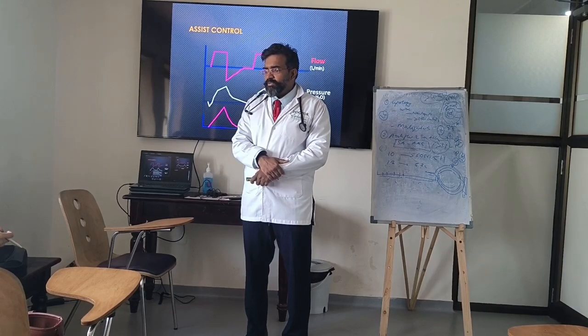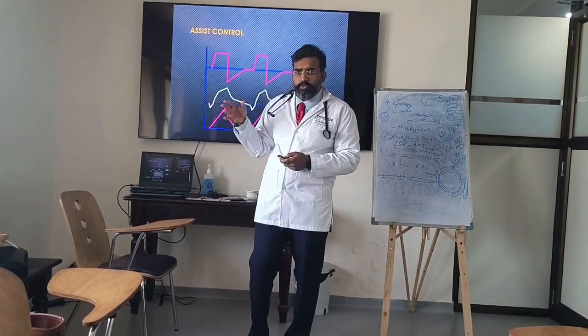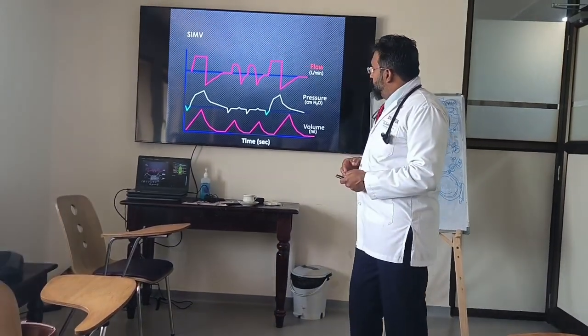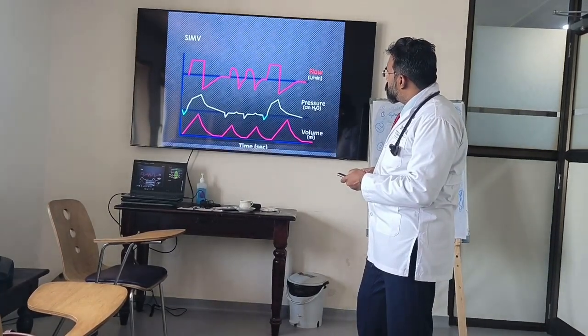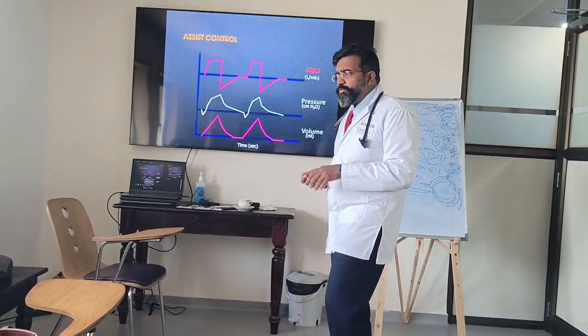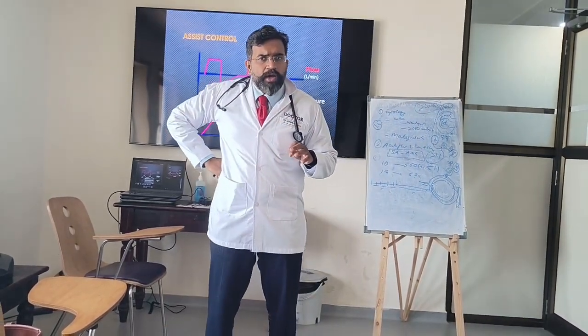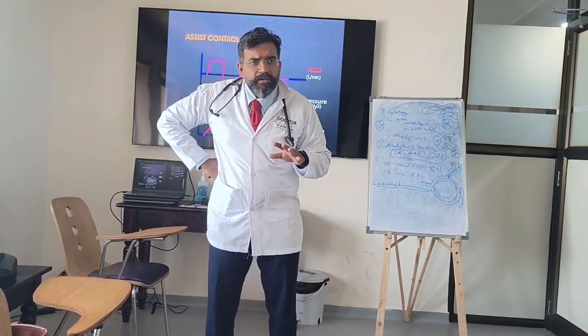We come to that. We are not in the modes, we are just in part of the mode as of now. We have not gone to the other cycles. Okay. So you are under assist control now. So this means to say, what is going to happen in this mode? Say tomorrow I breathe fast. What will happen to the ventilator?